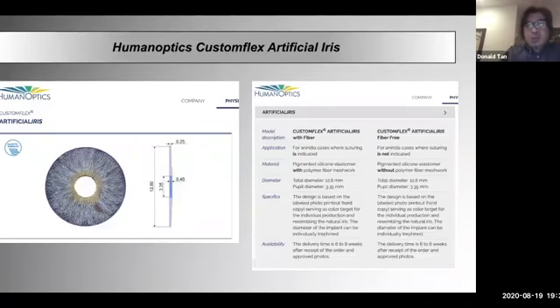The Human Optics artificial iris called CustomFlex is now available in many countries. It's FDA approved for the last 2 to 3 years, I think, in the US, and it's used mostly in complicated cataract surgery, where there is aniridia or a missing segment. This artificial iris is made out of silicone, comes with a whole iris shape like this. It's about 12.8 millimeters in diameter. So you can refine this to whatever size you want. And most surgeons, a lot of the time, to solve large iris defects, will cut this up into segments, right size, and just suture it in place.